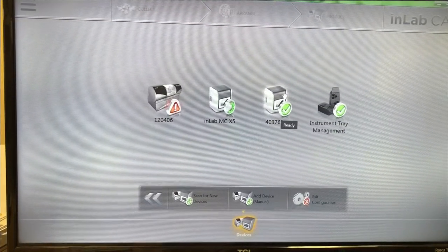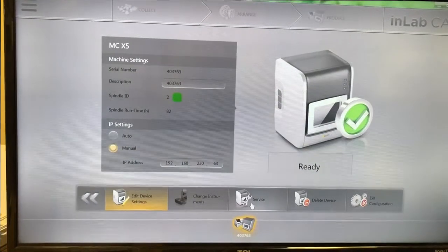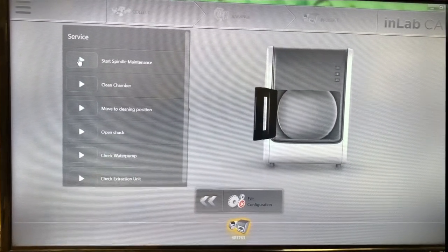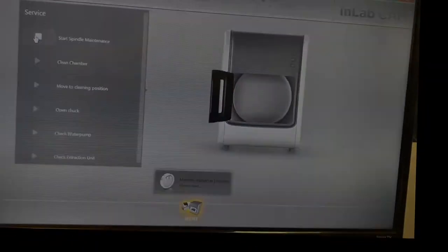Today we're going to be doing spindle maintenance on this particular X5, so I'm going to click on that, go down to Service and click on it. On Service you have different options. We'll start spindle maintenance and then we'll go over to our X5 to clean it.